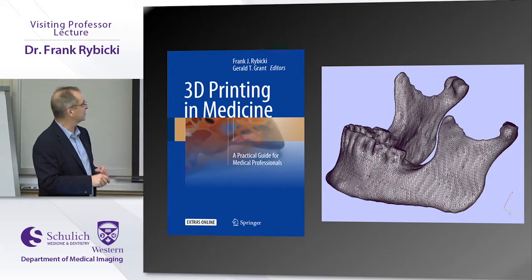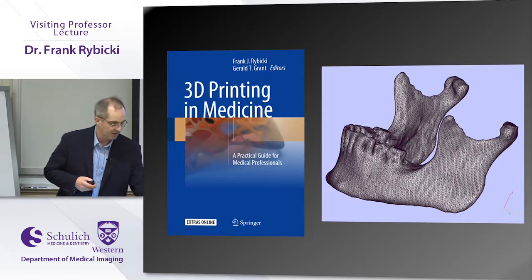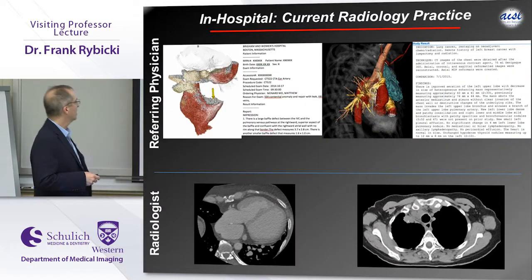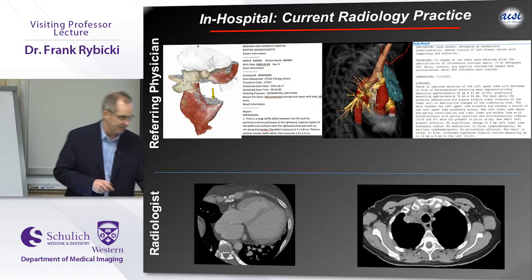And of course, this is relatively normal. What you want is one side that has the disease on it, and I'll show you different examples where the models are used. So this is a cardiac baffle. This is one of those Pancoast tumors. The best that we can do right now is this, right? And give a good report. These types of images are simply not going to make it.